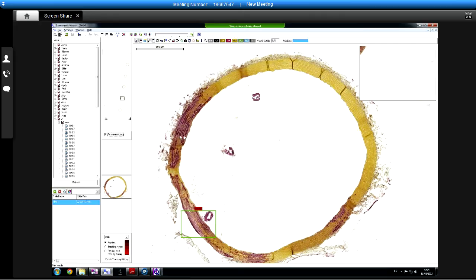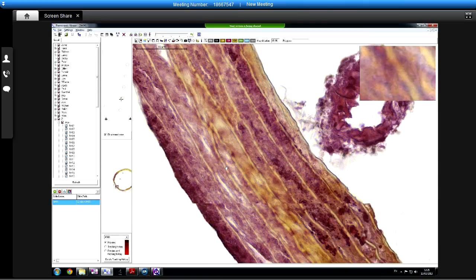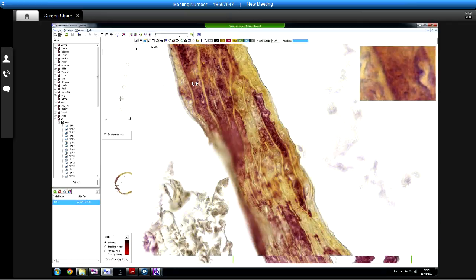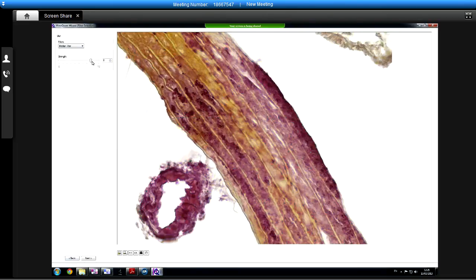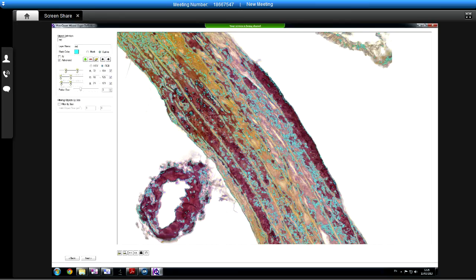We were actually selecting a different area to train. Yeah, I was just wondering about that. Maybe something like this. The other thing I was wondering was maybe this is having too much of an effect. Yeah, it is. Red and yellow are obviously very close to each other in the colour spectrum.